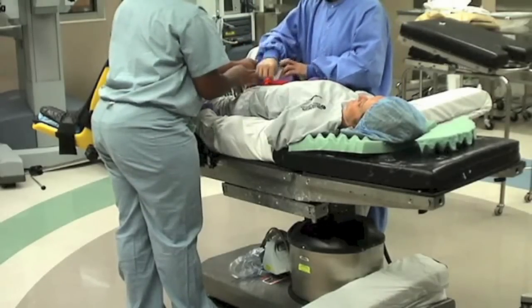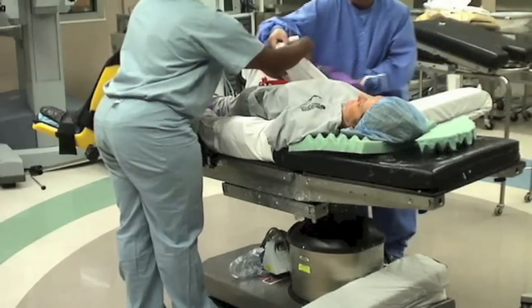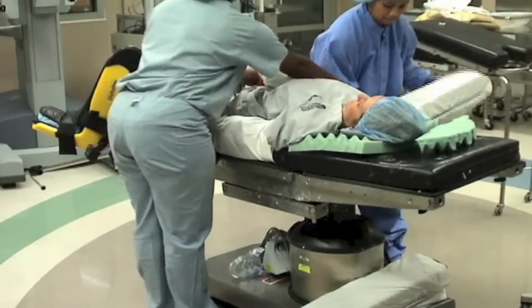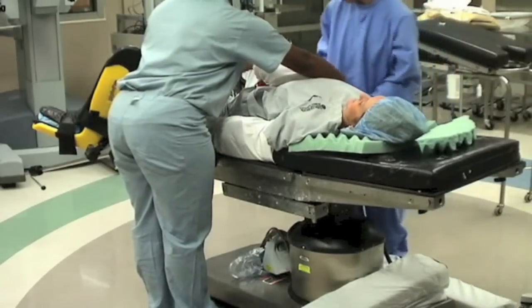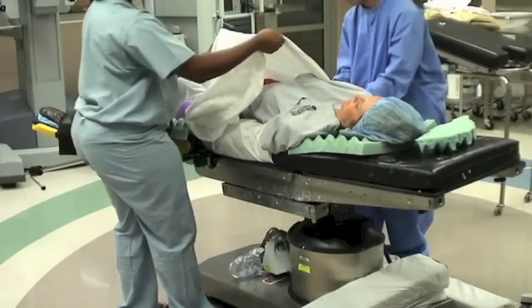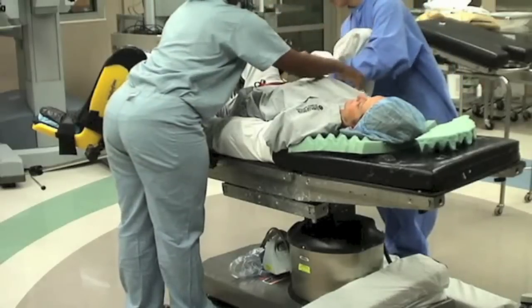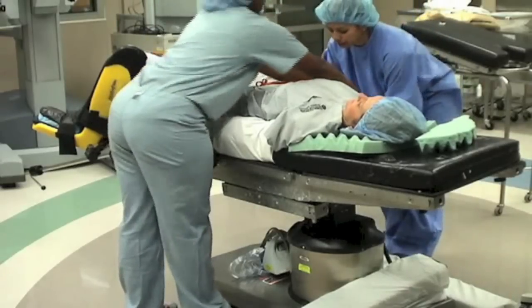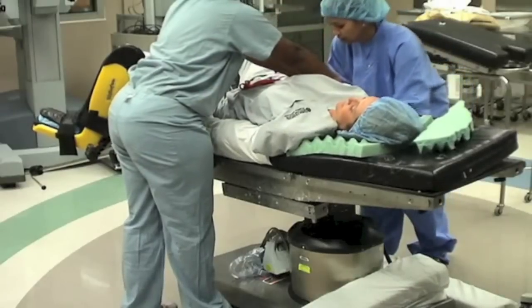After one arm is tucked, the process is repeated on the opposite side. Again, excess egg crate foam is removed. Cushioning is placed beneath the patient's elbow and wrist. The bed sheet is lifted over the patient's arm and the bedsheet is tucked beneath the mattress pad, and the excess egg crate foam is placed beneath the patient's hand.